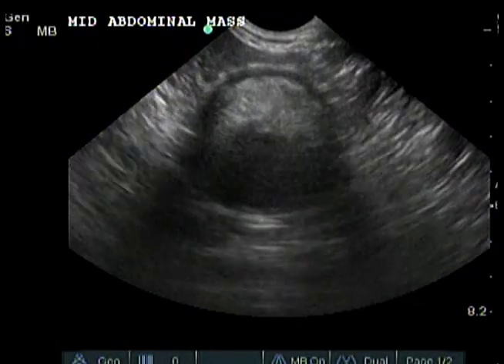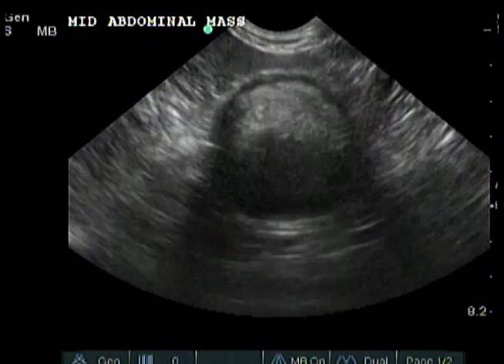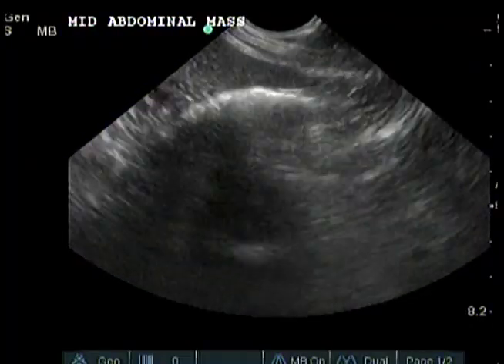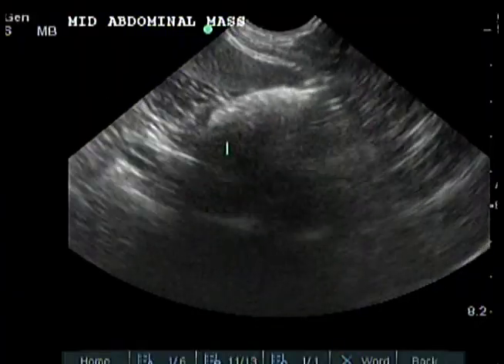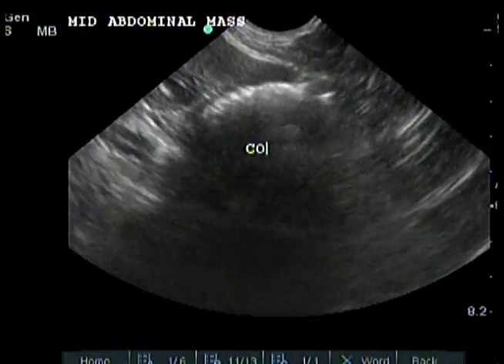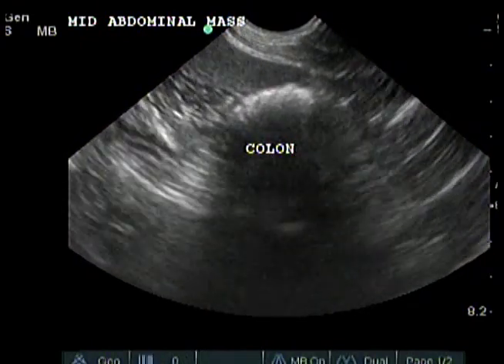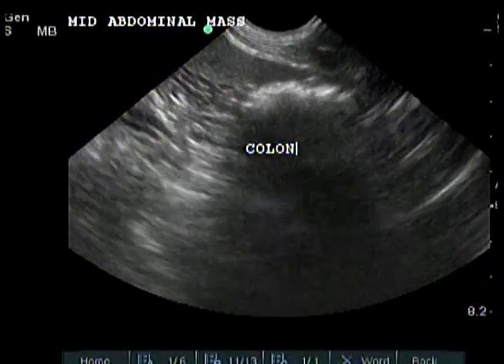This video is from a 9-year-old golden retriever with an intestinal obstruction due to a tumor. The lesion is seen as a dilated, atonic, ingesta-filled intestine, typically found proximal to the obstruction. This ingesta-filled intestine looks like colon and shows edge shadowing, but does not show acoustic shadowing typical of colon, nor is it in the expected location of colon.